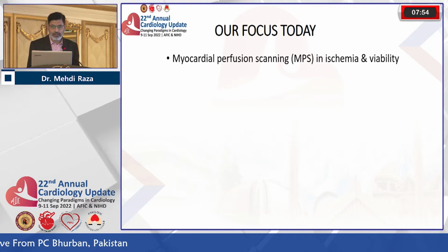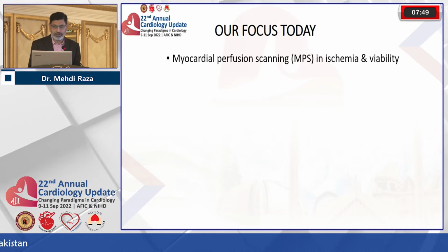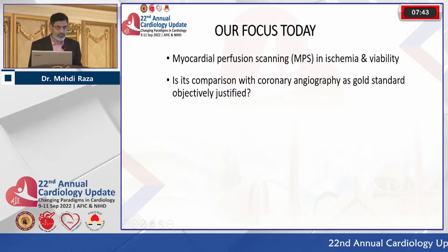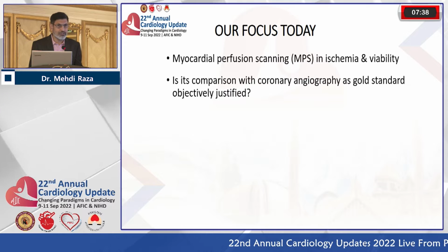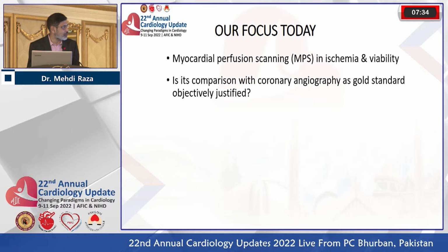Now, our focus today will be, like we've already discussed, on MPS or MPI in ischemia and viability, its comparison with angiography. Let's talk of this first. Is it justified? We were just now talking about CT angio, which is another form of luminography, like the conventional coronary angiography.